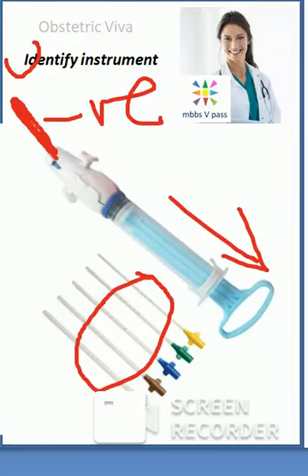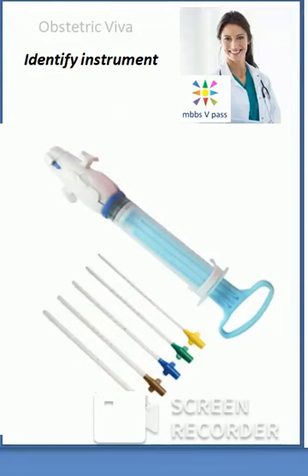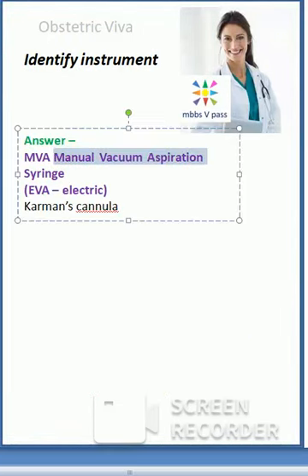Obviously, you guessed it right. It will go inside the uterus via the cervix, which you would have dilated first. And whatever is there in the uterus, you will suck out with this negative pressure. Correct? So what is the name of the instrument now? Manual vacuum aspirator syringe. Manual vacuum aspirator.